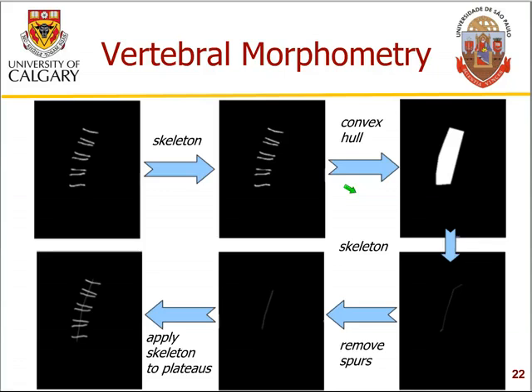To measure the variation in height for each vertebral body, the automatically detected result, which is shown here, was skeletonized, which is shown here, but if we were to draw the skeleton, it will be only 1 pixel thick and difficult to see. So actually this is not the skeleton, but the same image repeated.